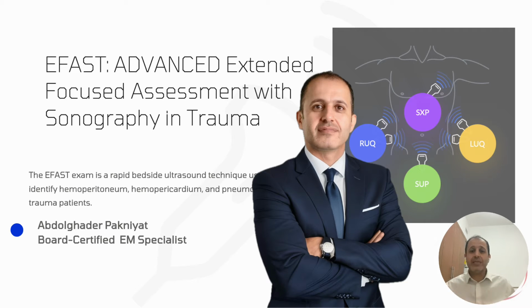Otherwise, just using the ultrasound may sometimes not be safe, as you can interpret something as pathologic when it is normal, or you can miss some pathology and just say it is normal. So this course is not for getting skill. It is just to be familiar with this subject.